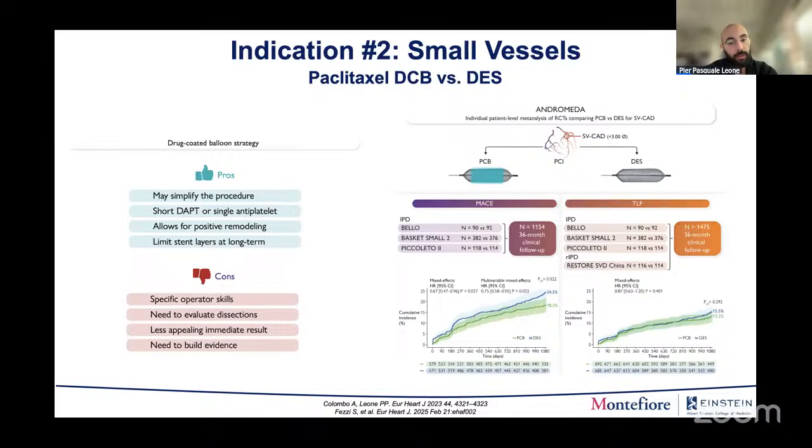So I think these results are really, really important. The other thing about all of these studies, I would stress, is that the curves seem to still be separating at 3 years, which is also fascinating. We talked last week about how, with stents, there's this increased event rate over years, like 2 to 3%. There still is with the drug-coated balloon arm, but maybe it's slightly flatter than with the stent arm, and the two are separating even more as we get to 3 years. So I think that's fascinating.